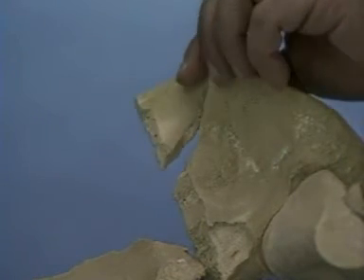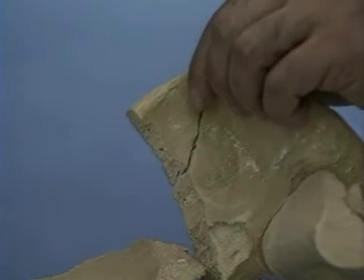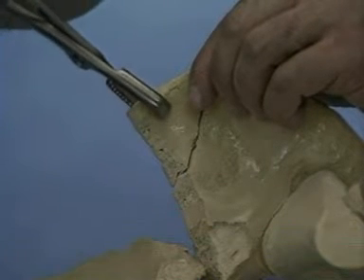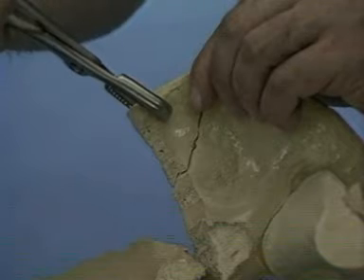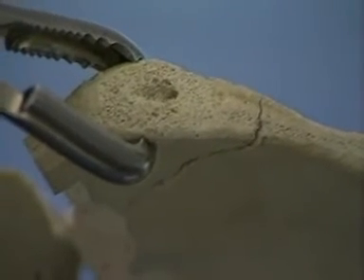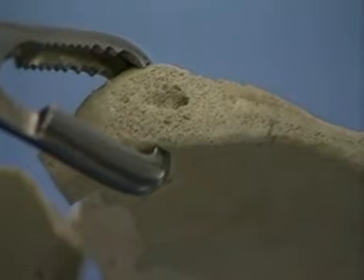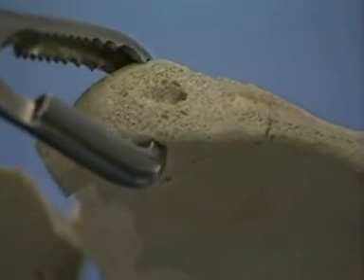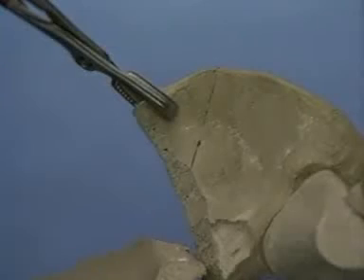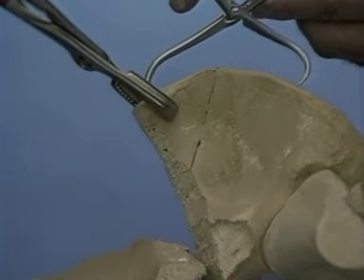The triangular segment of the iliac wing is reduced into place with a Farabeuf clamp. The reduction is held with the pointed reduction forceps.